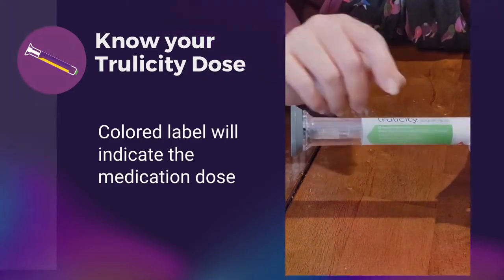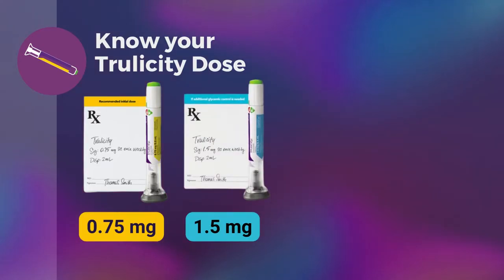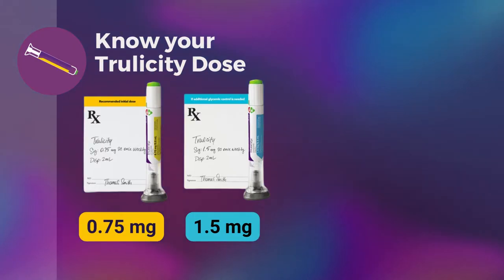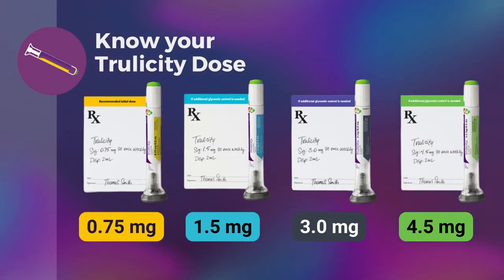There are four doses. If this ribbon is yellow, it's the 0.75 milligram pen. If this ribbon is an aqua blue, it's the 1.5 milligram pen. If this ribbon is gray, it is the 3 milligram pen. And finally, if this ribbon is a darker green color, it is the 4.5 milligram pen.